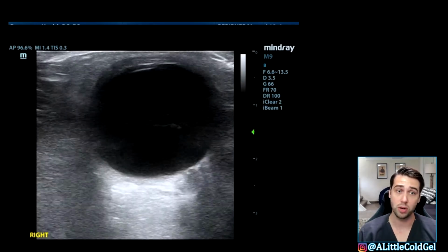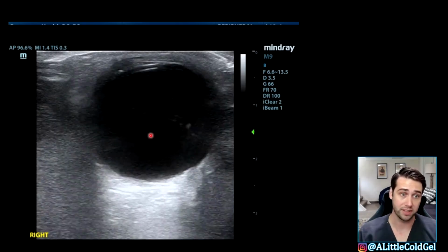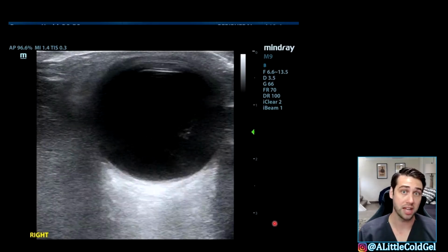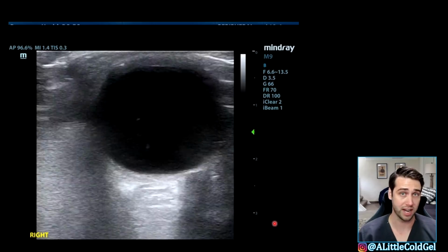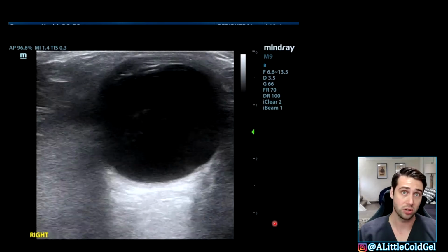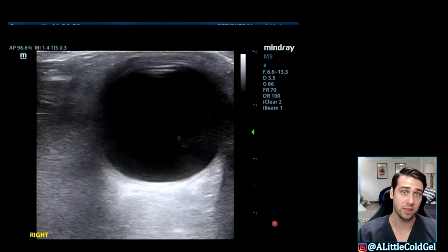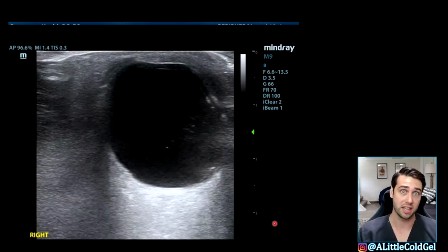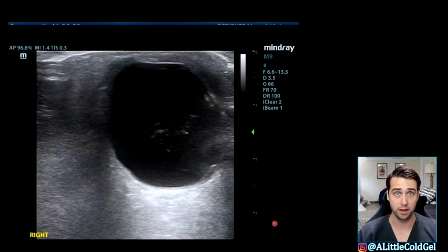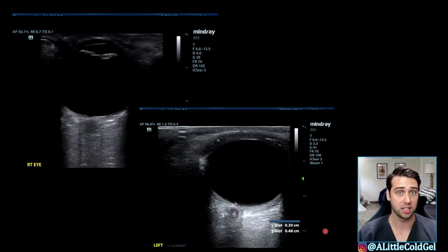And so basically what we're looking for is this spinning stuff in the back of the eye. All that stuff that is supposed to be in the anechoic posterior chamber is now hyperechoic, and as you can see, it's very mobile when we have them move the eye. So put the probe kind of right in the middle where you can see a good segment, and slowly increase the gain as you're having the patient move their eye back and forth for you, and this will give you that nice, bright, swirling stuff in the back of the eye that usually either represents a posterior vitreous detachment or a vitreous hemorrhage.